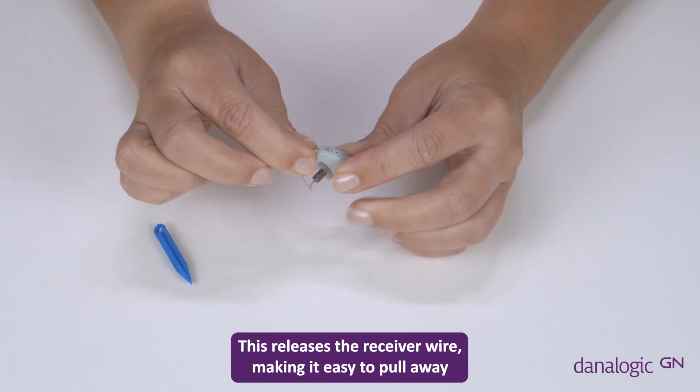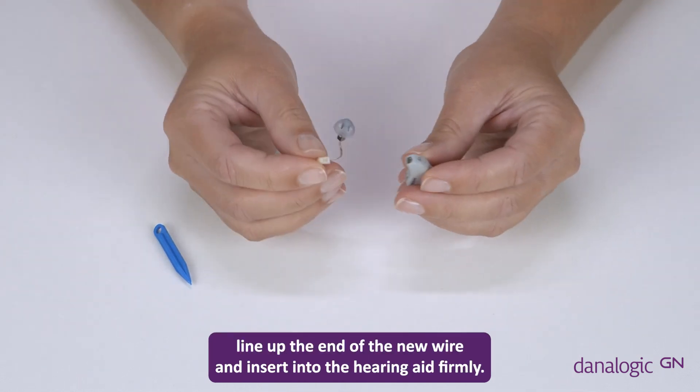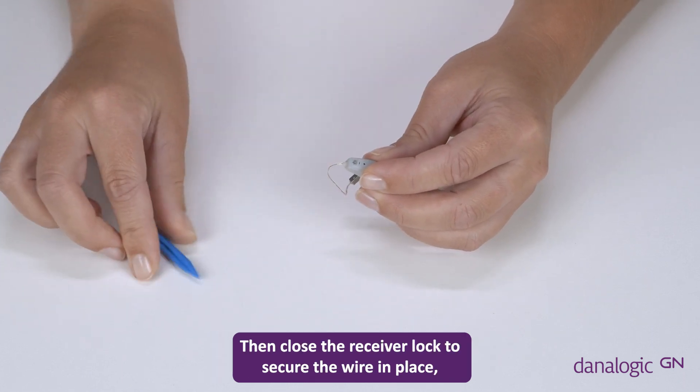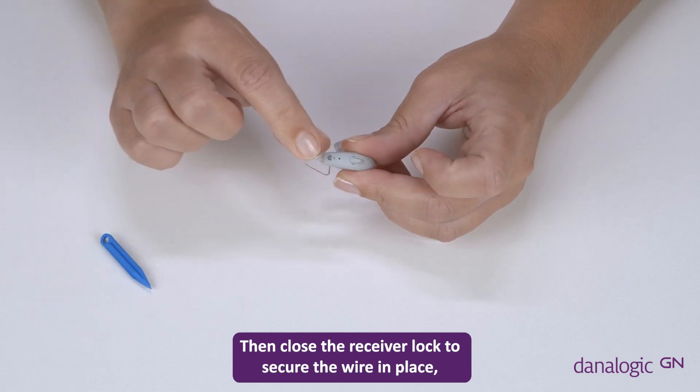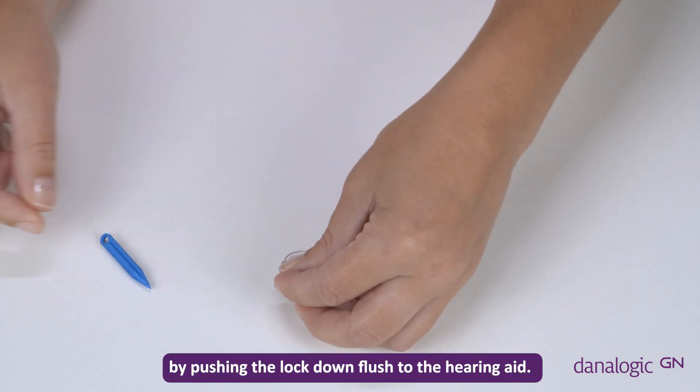This releases the receiver wire, making it easy to pull away from the hearing aid body. To insert your new receiver wire, line up the end of the new wire and insert into the hearing aid firmly. Then close the receiver lock to secure the wire in place by pushing the lock down flush to the hearing aid.